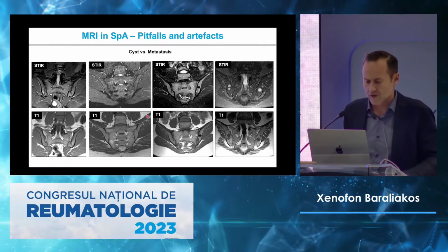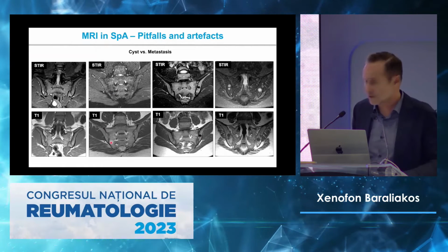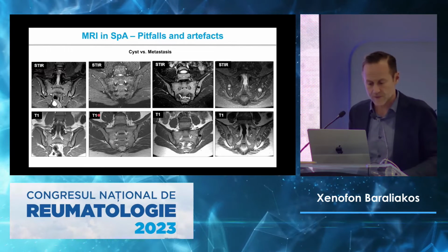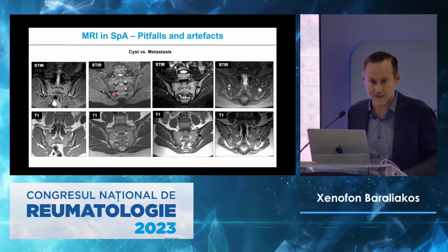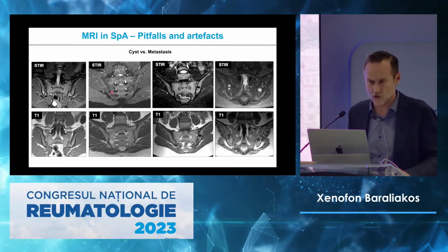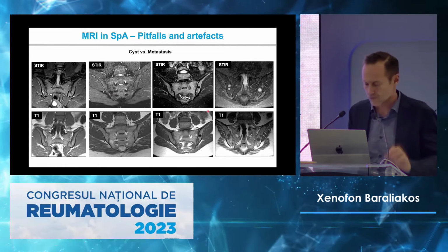Yeah? If we look at that black part here, which is white down below, you remember T1 is able to find fat, which is black on normal STIR. So that must be fat. It's a fat island or fat cyst or whatever you call it. It's a little bit further away from the joint, also just one single lesion. Yeah, it doesn't really do much.